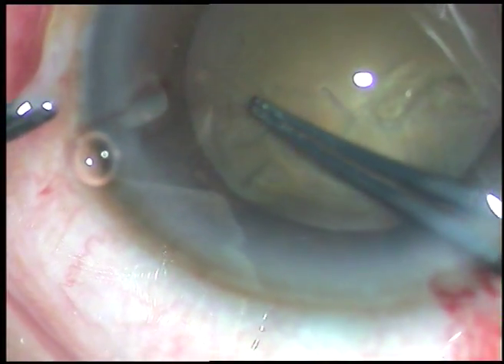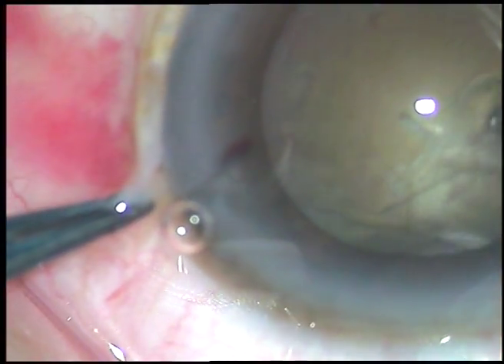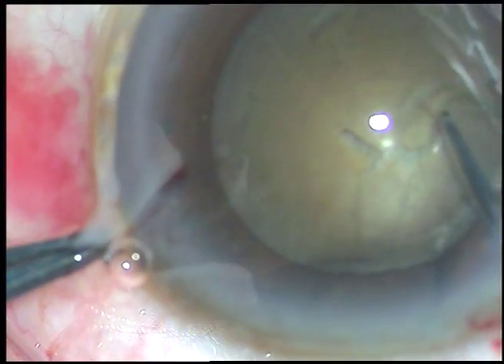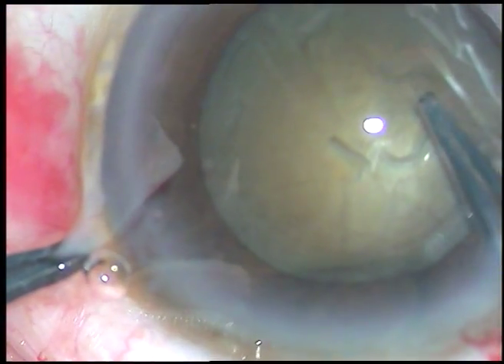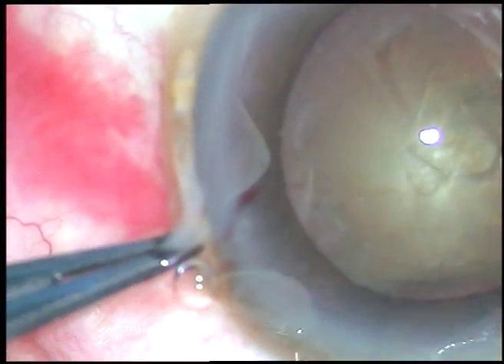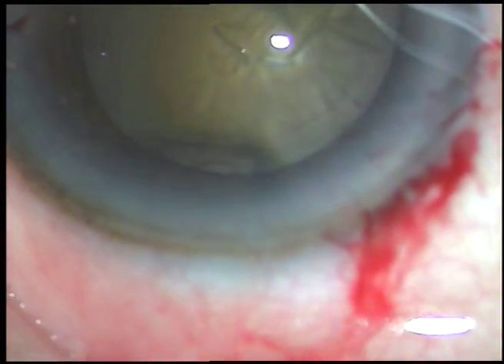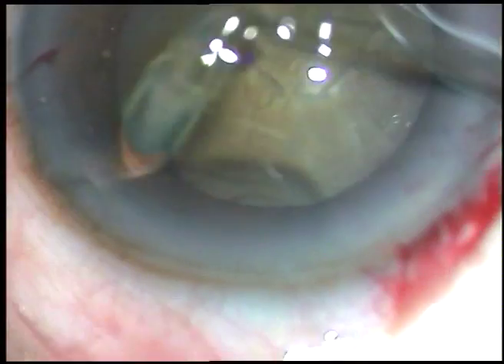As I do the rhexis, I rest on the anterior lip of the main incision. I apply an upward thrust on the anterior lip and never depress the posterior lip. Thus I prevent leakage of viscoelastic substance.